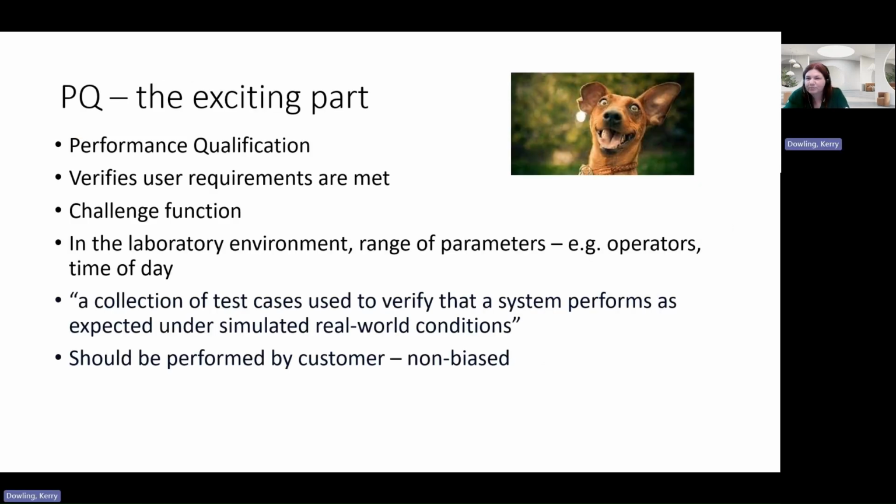The part that's really important to us, and the part that should be done by the laboratory: sometimes you'll get companies offering to do the PQ, or the performance qualification, for you. That's not really a good idea, because this is about you and your lab and how it works in your system. So the PQ should be done by the laboratory team.